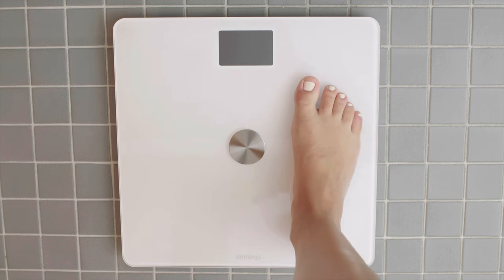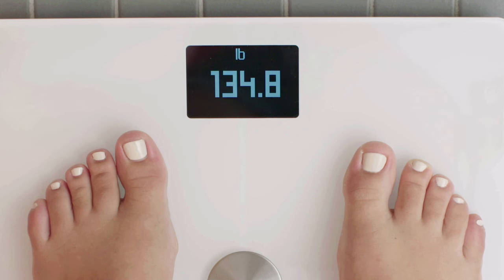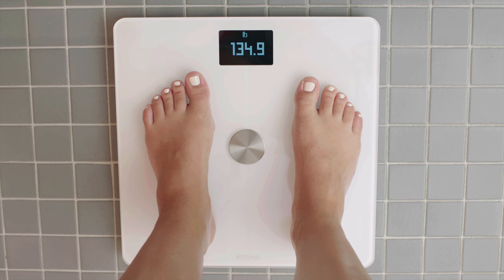Step on the scale. Your weight will start to be read. Withings uses position control to help you know when you are standing with your weight distributed evenly. If you see an arrow, it means you need to center your weight — lean slightly in the direction of that arrow until it disappears. Once your weight blinks once, your weight has been saved.